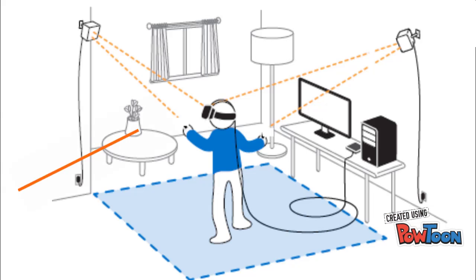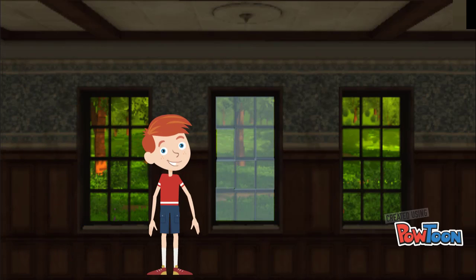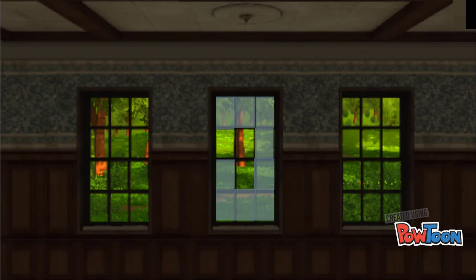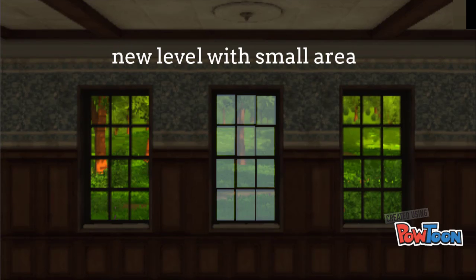The patient wears the VR headset to visualize an imaginary environment which contains the exercise he should perform to accomplish the session. The first level in the game requires the patient to wipe out the dirty areas from the window by moving his hand above the window in any pattern. Now, another problem may appear. The patient is not able to reach the top and the bottom of the window. So, the therapist will change the game level where the patient is required to wipe out a small area.